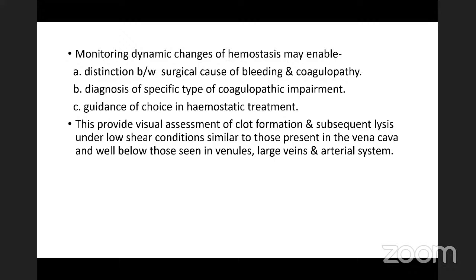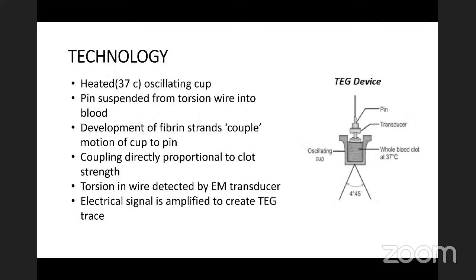This provides visual assessment of clot formation and subsequent lysis under low shear conditions, similar to those present in the vena cava and well below those seen in venules, large veins, and the arterial system.